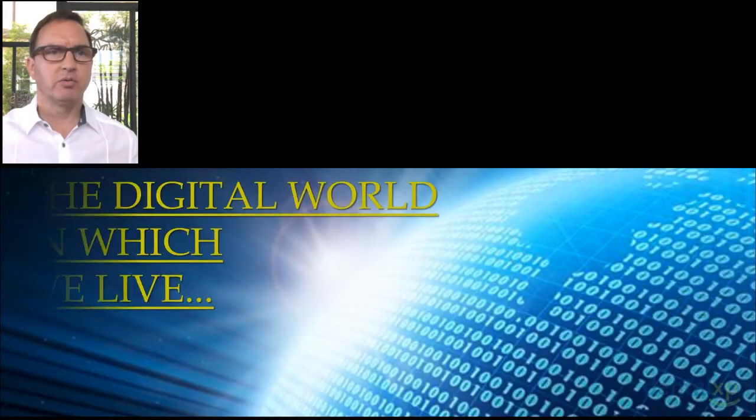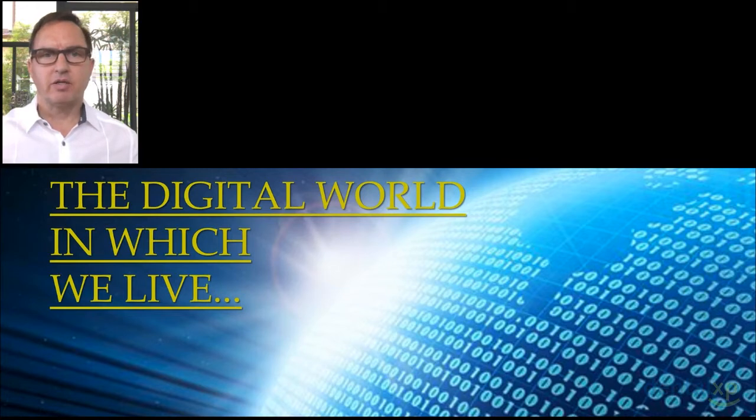Today we live in a digital world. Everything around us has changed, and we are adapting as best as possible to it. Some resist change and are laggards, others adapt easily to change and find that it suits them. We're all a little bit digitally challenged as the workflows around us are continuously being modified, they're new.